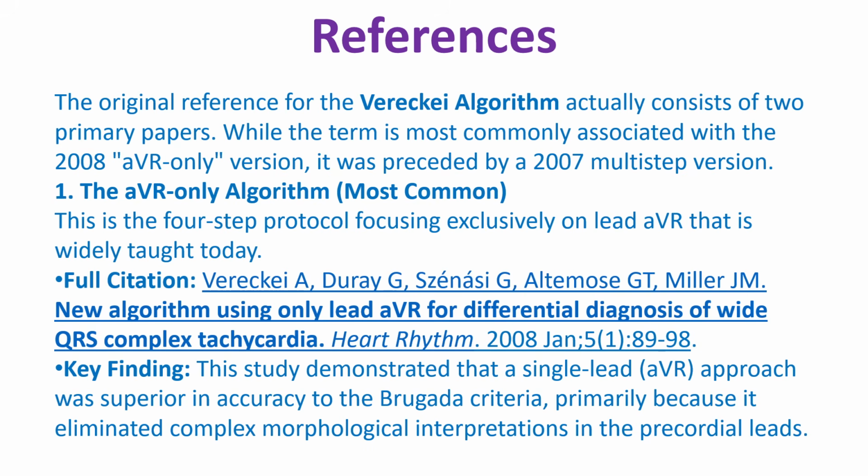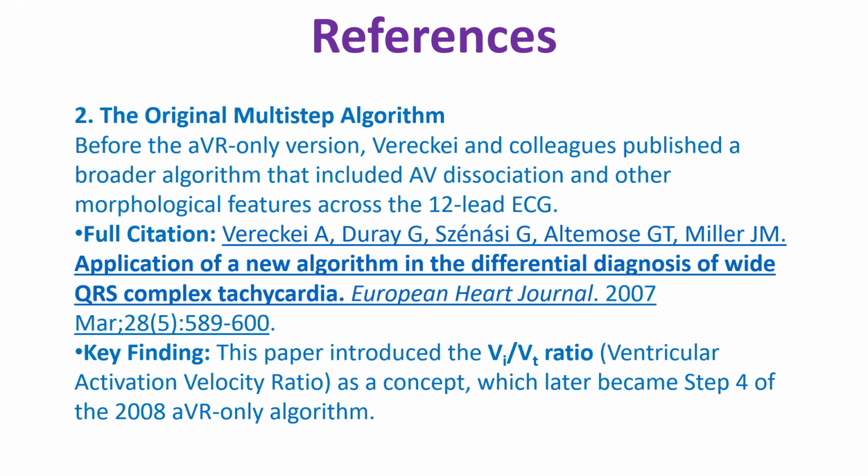This study demonstrated that a single lead AVR approach was superior in accuracy to the Brugada criteria, primarily because it eliminated complex morphological interpretations in precordial leads. Here is the reference for the original multi-step algorithm.